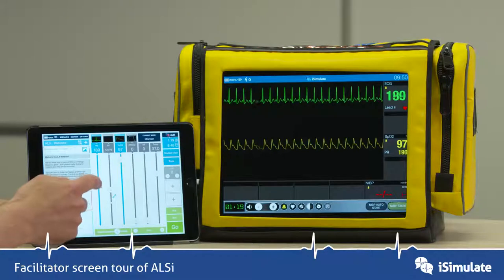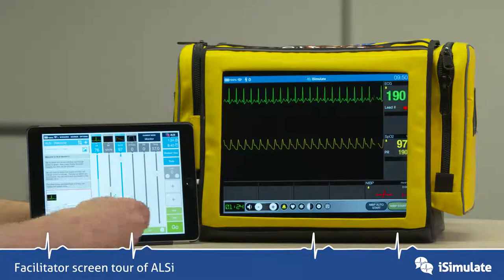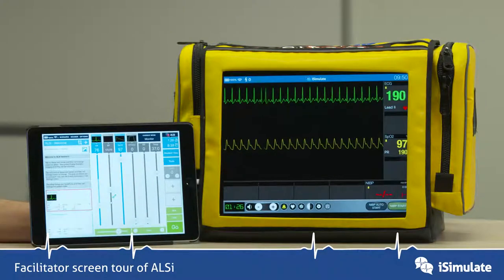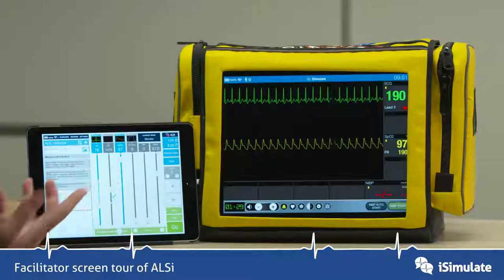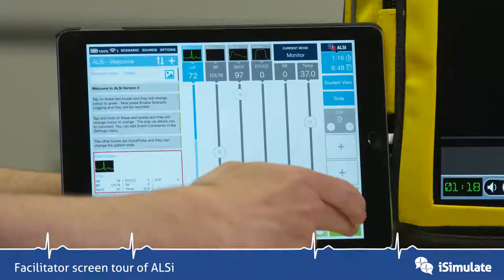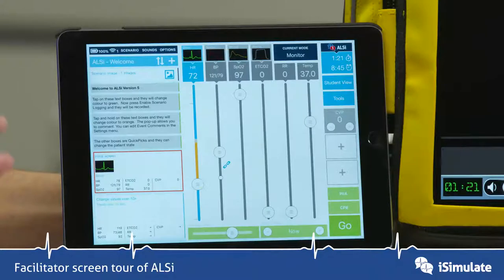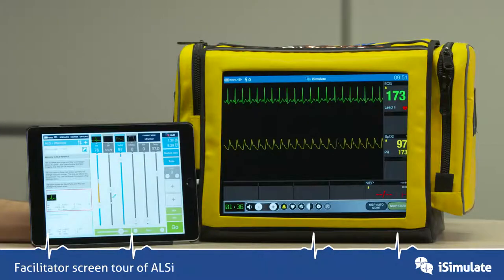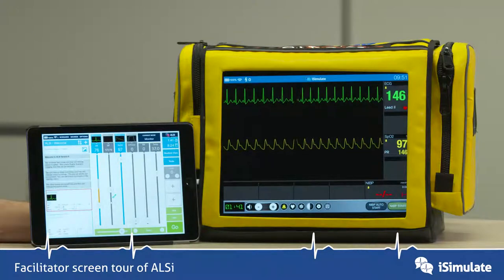To bring the heart rate down I can just move the slider down, but I can also do this by trending. In these bottom controls I can set the trend over say 20 seconds and then press go. What will happen now is that the heart rate will come back down to 76 beats per minute, but it will do it over 20 seconds as you can see happening there.